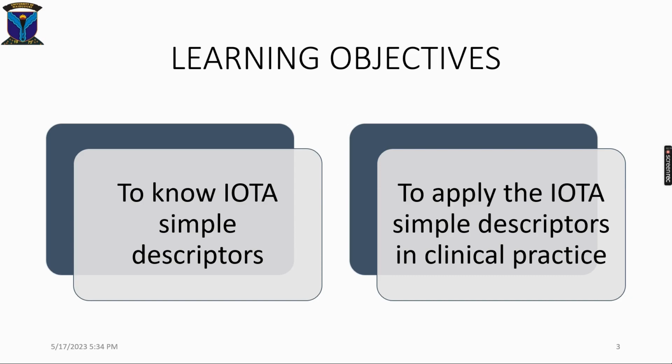The learning objectives are to know the IOTA simple descriptors and, most importantly, to apply the simple descriptors in clinical practice.